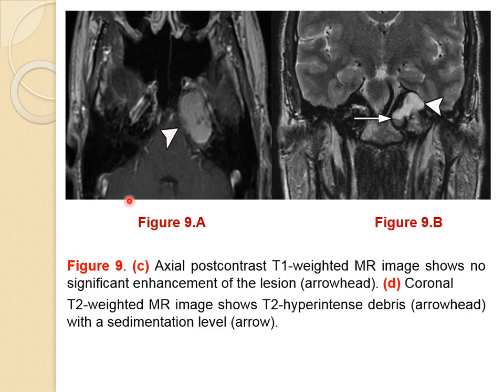On the post contrast image, we see it's not enhancing. No enhancement, good. Cholesterol granuloma shows no enhancement. We see a sedimentation level; the line between the arrows shows the sedimentation level.